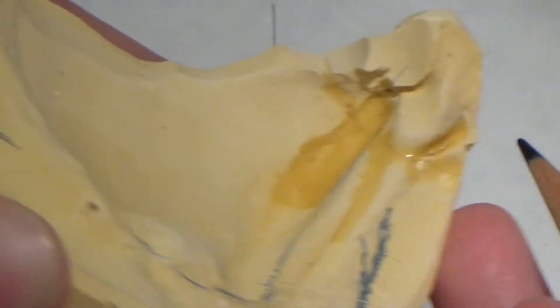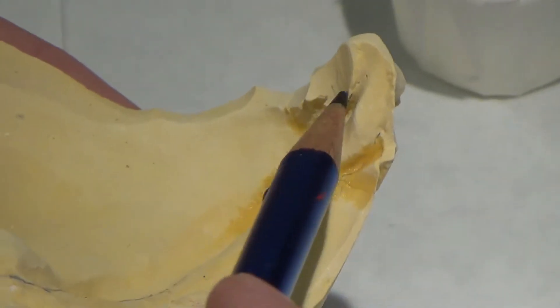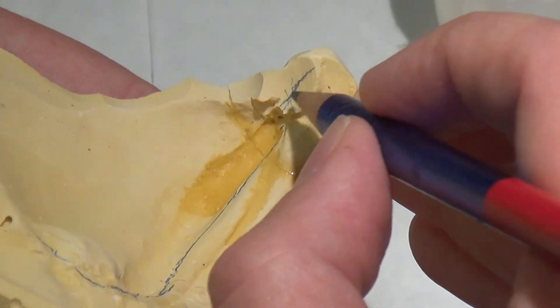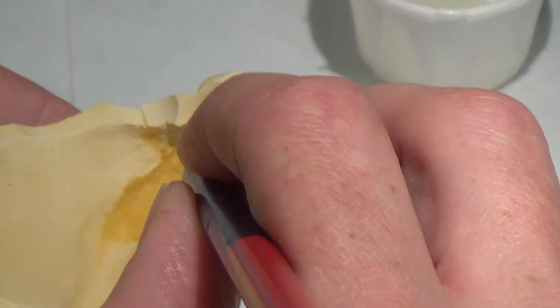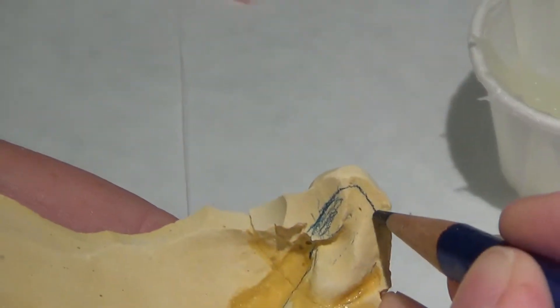I need to get anatomy. Can y'all see this little area right here, where the alginate kind of folded over, and I had a void there? So I need to make sure that I don't come around this. I need to go over it because I need my tray to be long enough. I'm missing some anatomy right here. So in order to overcome that, I have to make sure my tray extends beyond it and covers it.